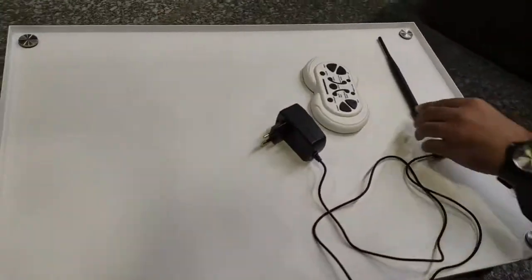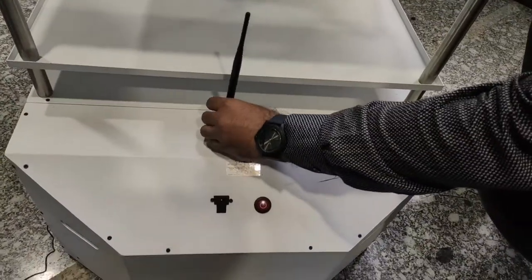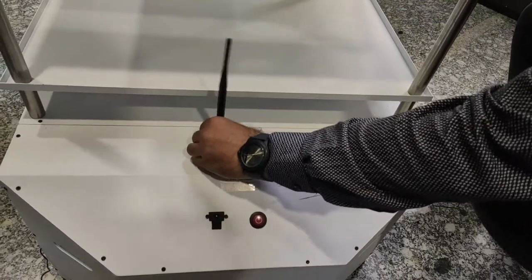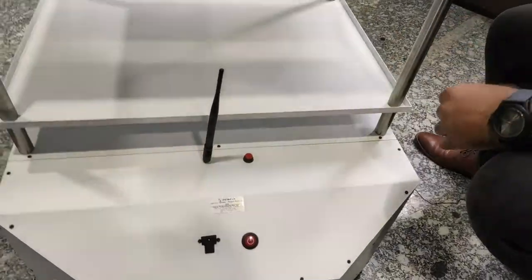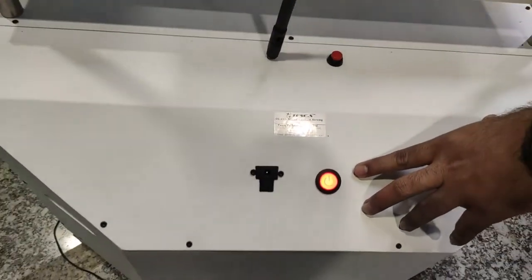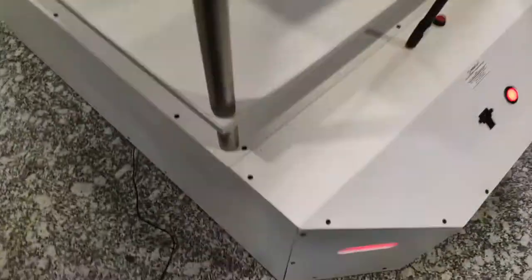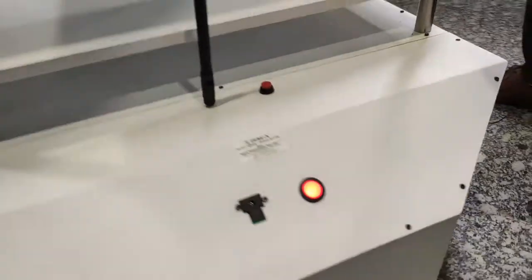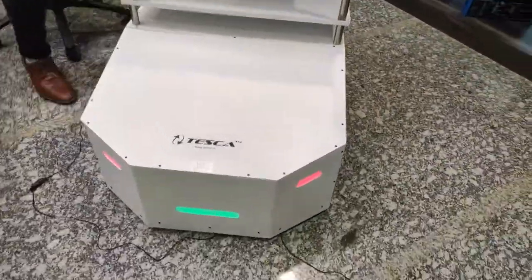We also need an antenna for transmitting the remote control signal, and this antenna is installed here. This is the main power-on button for starting the device, and these are the indicating lights which are placed at the front and rear end of the cart.